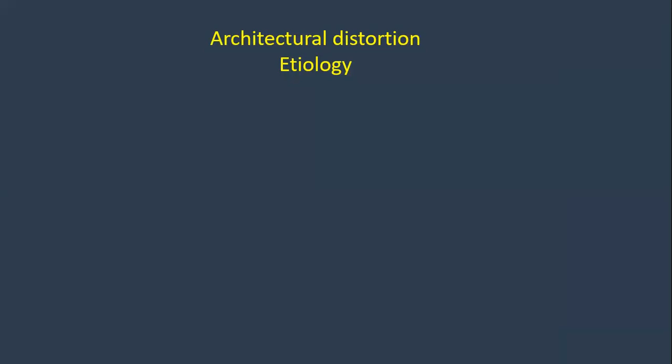Okay. So what are the etiologies of the architectural distortion? What are the causes of the architectural distortion on mammography? What do you know about the causes of architectural distortion? How can we divide it? Hint. We can broadly divide it into benign causes and malignant causes.